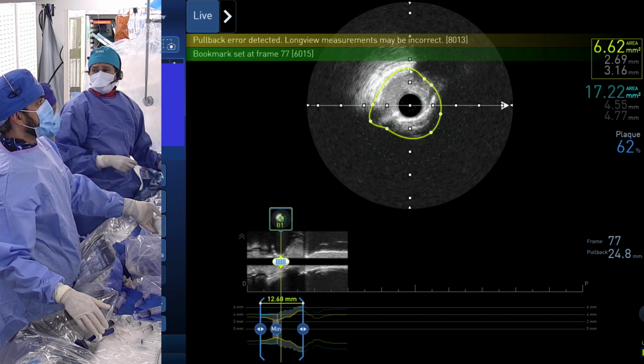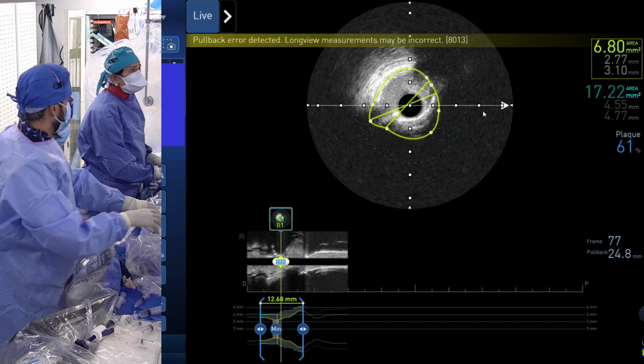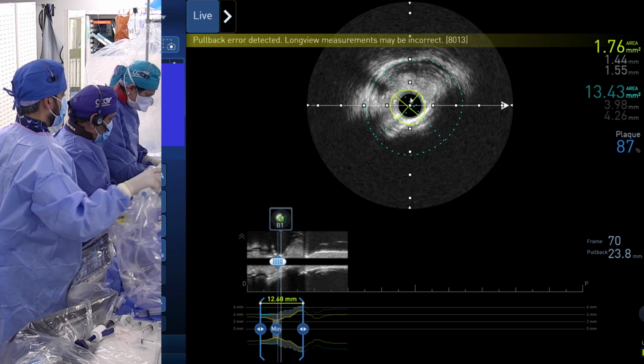No, I think you're in the wrong area. He does not know anything. You want to check it? You want to go there? Go, I'll take care of it. Just show everybody the ostial. So that's the decision making.